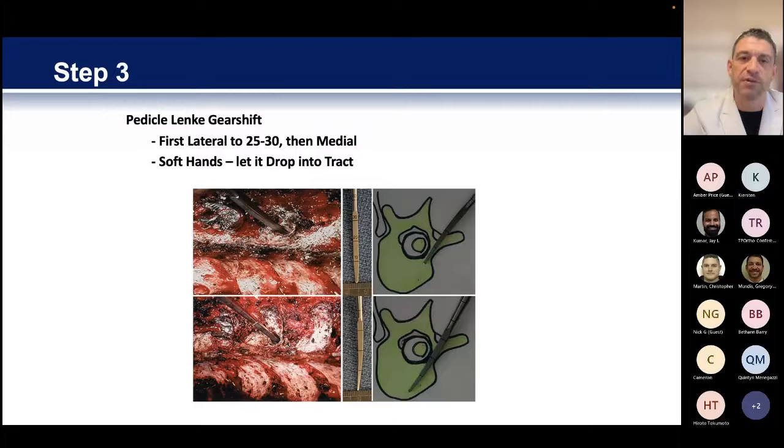And then after about the 25, you come out, you palpate it, you switch it by 180 degrees and orient it medial, and then place your probe all the way into the vertebral body using that methodology. In general, this works nice. As you can see, these are some of the things that you're trying to avoid, right?